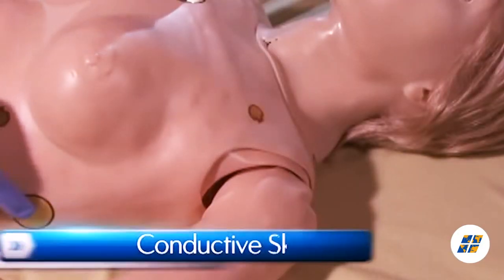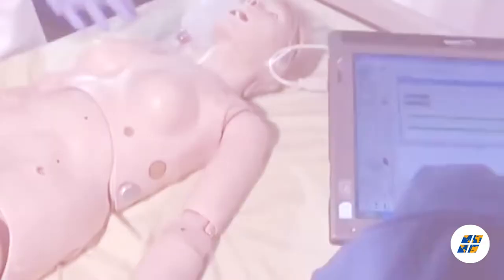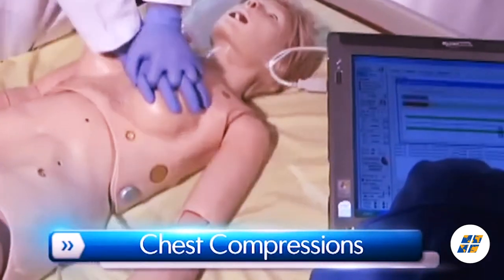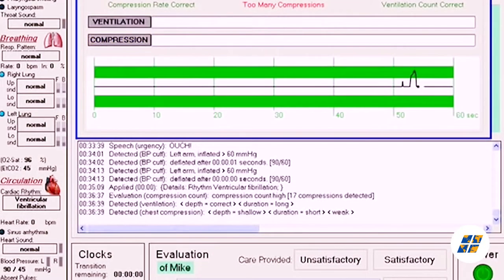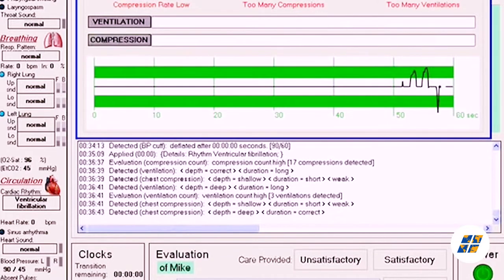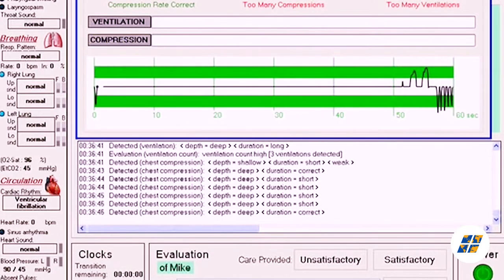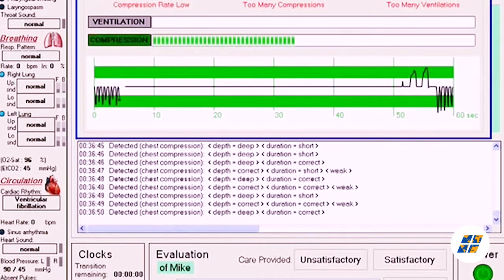Suzy's conductive sites are conveniently placed anteriorly to allow easy access for pacing. Chest compressions are measured and logged, showing the instructor exactly how students are performing. A full CPR sequence can be done with Suzy, and the providers will be automatically evaluated on different aspects of the compressions and ventilations, such as rate, strength, and ratios.